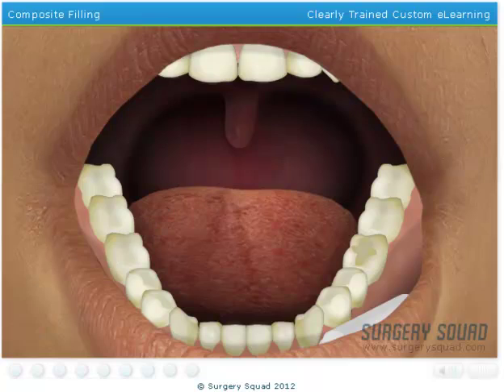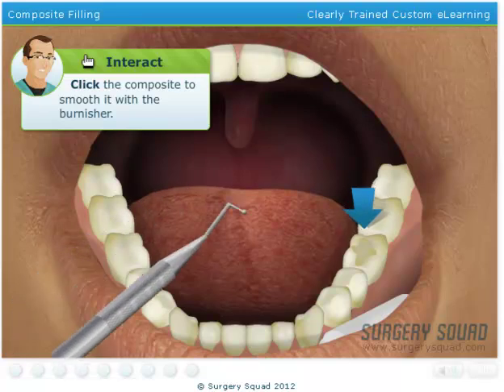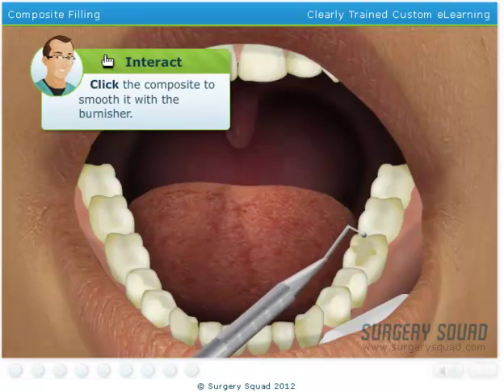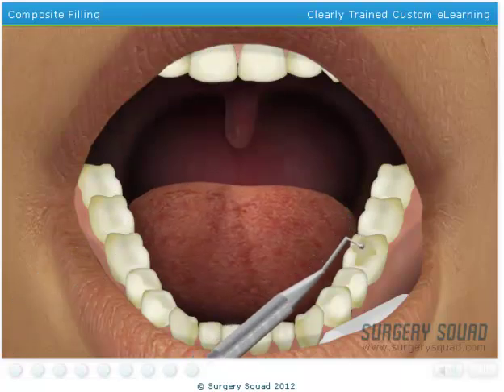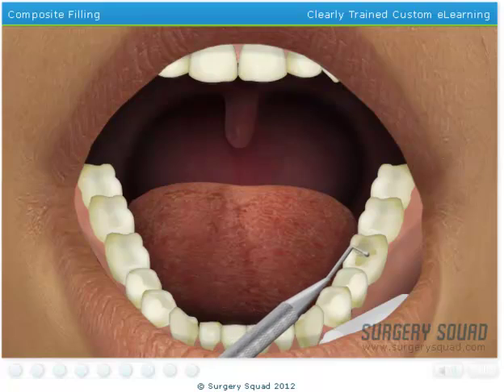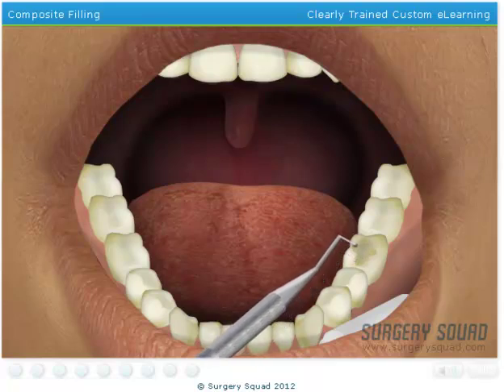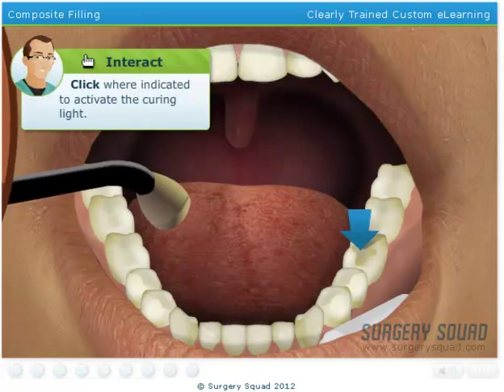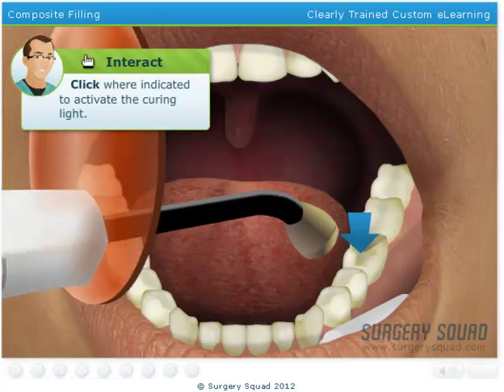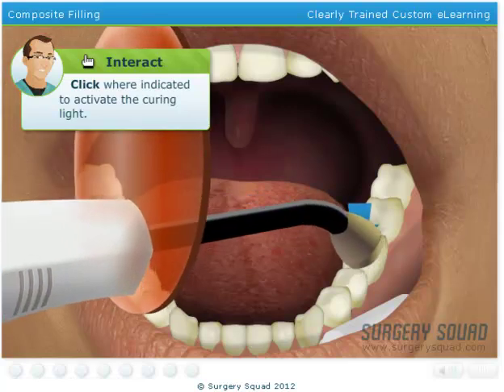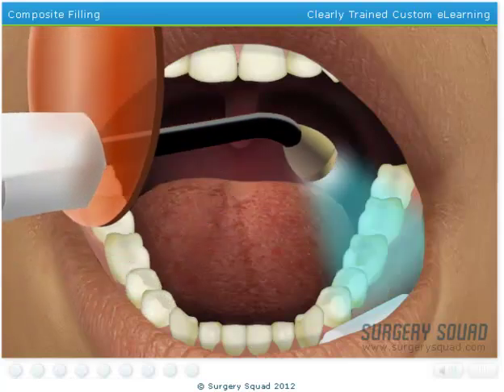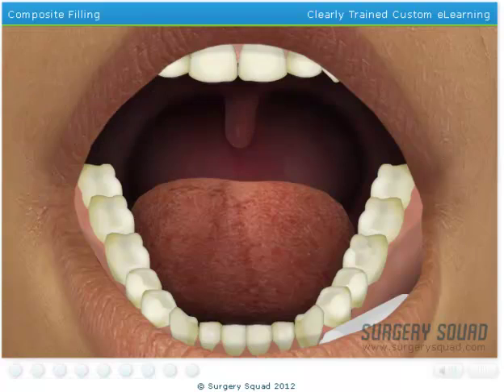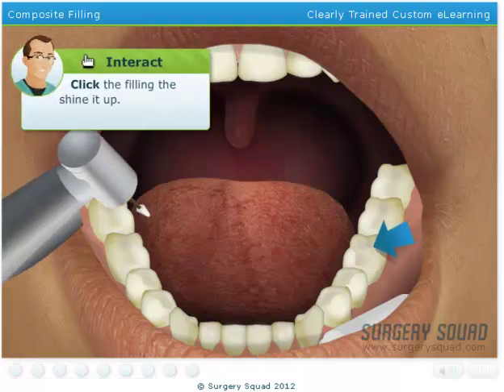Pack the composite into the prepared area of the tooth using a condenser. Next, smooth the filling using an instrument called a burnisher. Finish the filling using the polishing instrument.